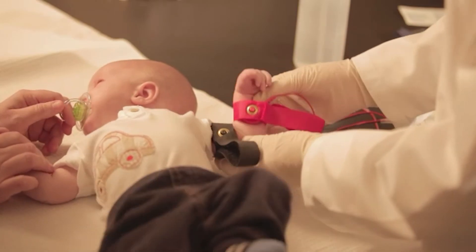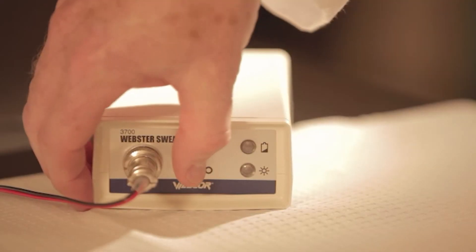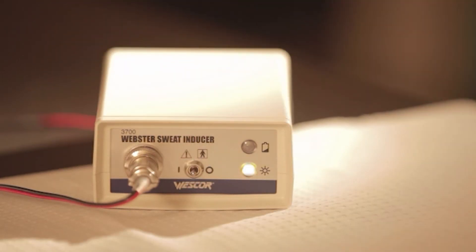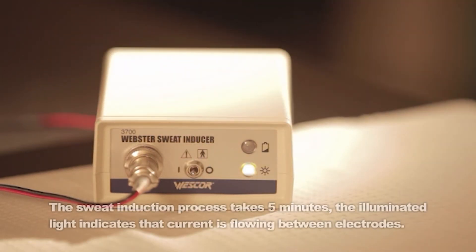Secure the electrode firmly so that the gel surface is pressed flat against the skin. There should be moderate pressure to minimize discomfort, but do not tighten so much as to crush the gel disc. Press the control switch to the run position and hold momentarily until you hear a short beep.